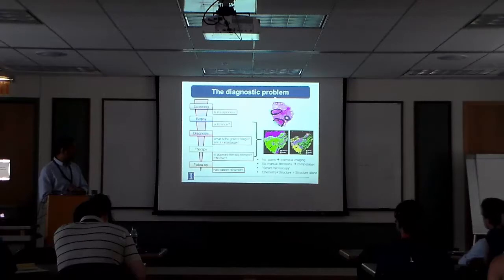So our diagnosis would be that there's a lump of tumor here, there's a lump of tumor there, there's a little focus of tumor down here, and otherwise it's normal. So we go back, and our pathologist indeed confirmed that they missed this little section of tumor there. There's actually a little bit of tumor there. They were quite happy seeing this, and those are the 2 major foci. To be fair, you don't need to look much beyond that.